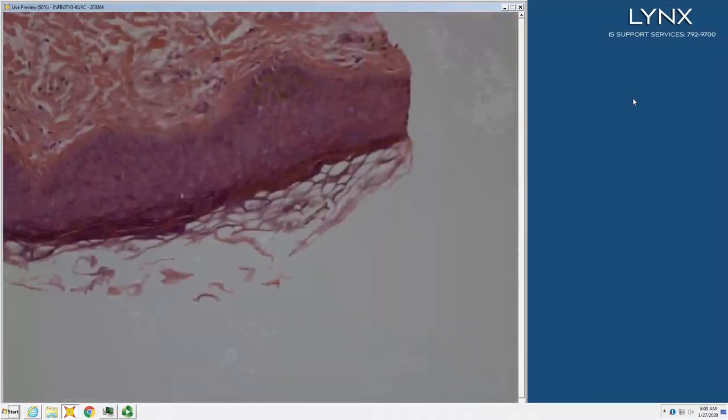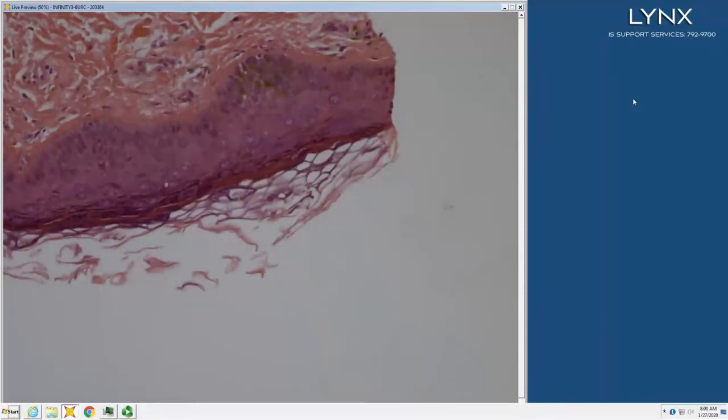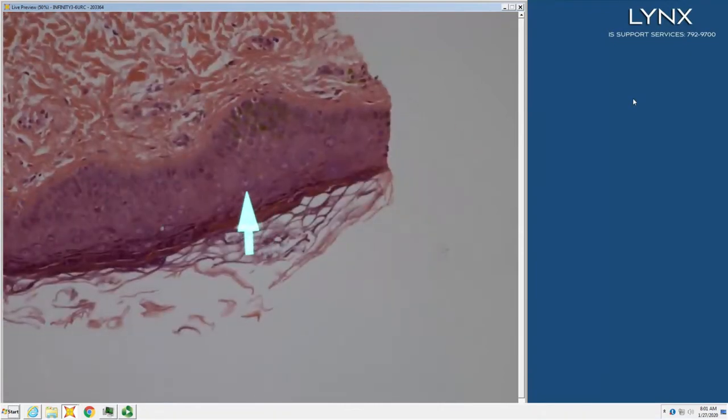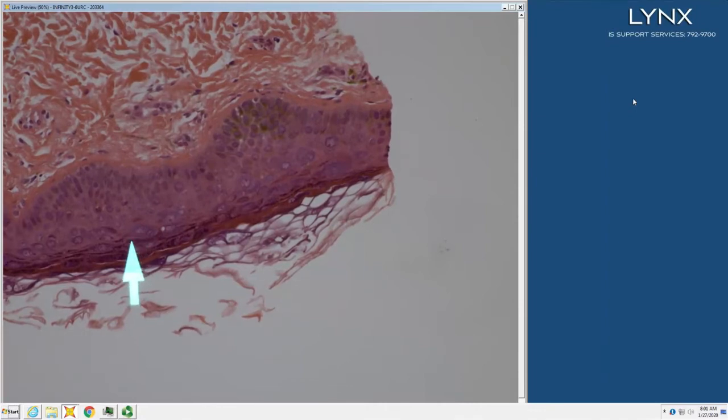So, looking up in the corneum, it's kind of abnormal. So tell me about what's wrong with the corneum. It's kind of flaking off. Also kind of a coarse basket weave. What do you think about the cells around the granular layer? Oh, the bluish hue, like EDV.